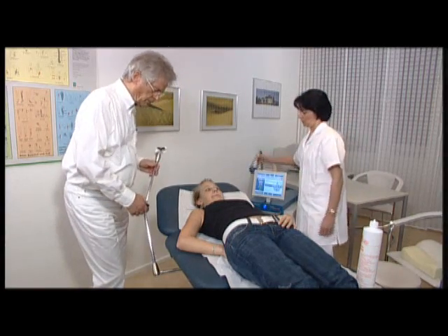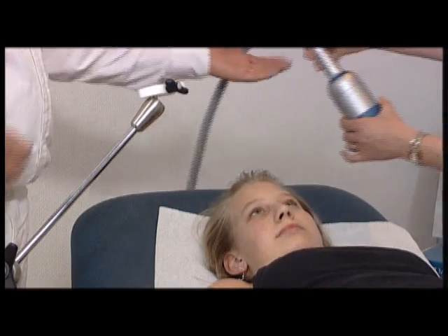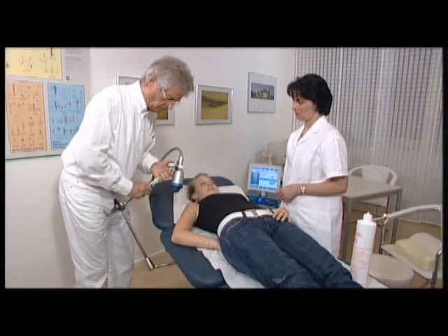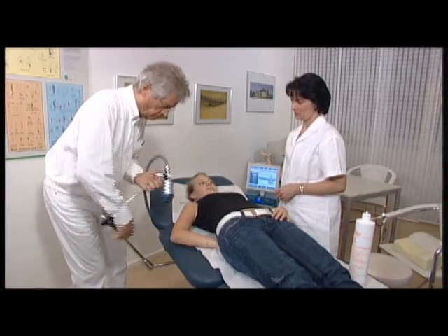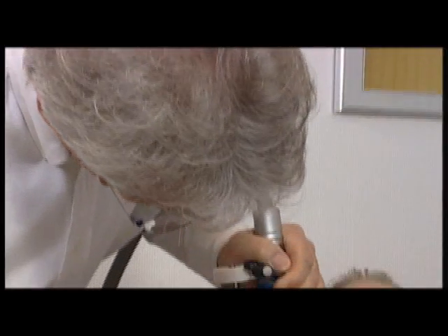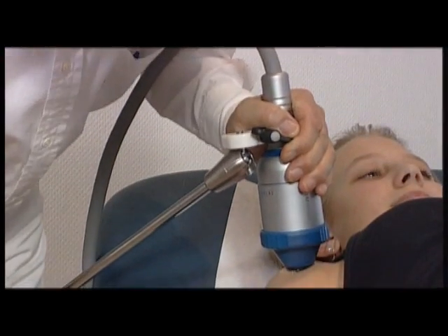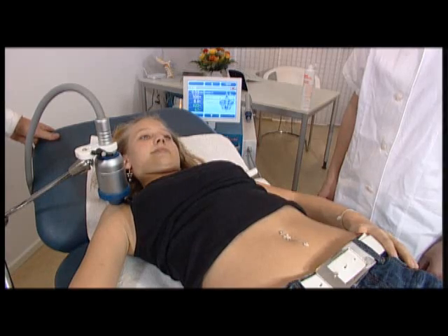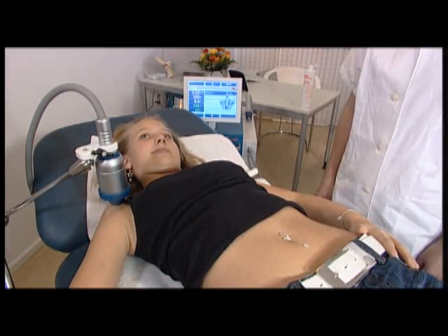If specific spots rather than larger areas need to be treated, an optional articulated arm can be used to fix the applicator. Shockwave systems developed by Storz Medical are synonymous with therapeutic individuality and offer ultimate versatility in orthopedic pain therapy.